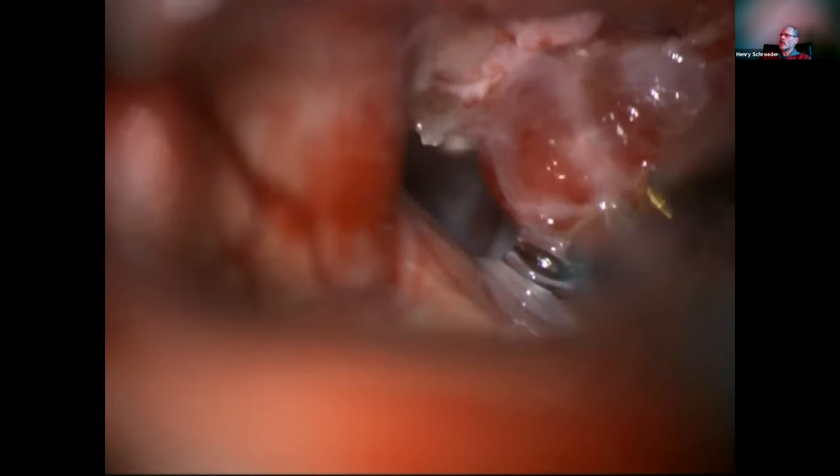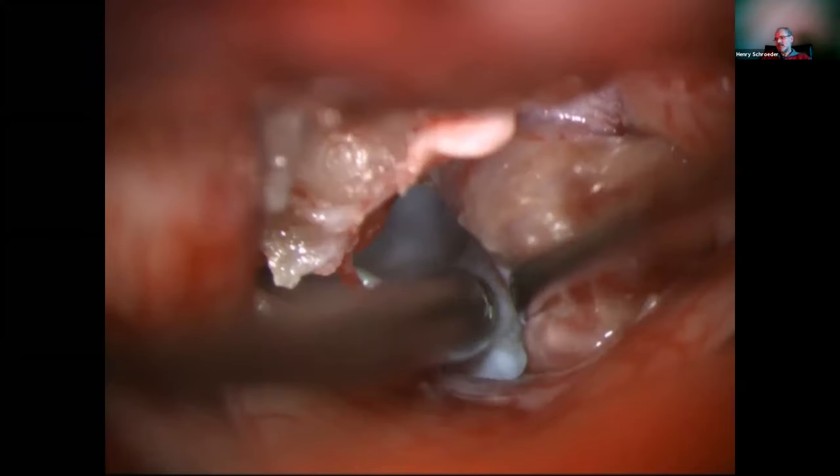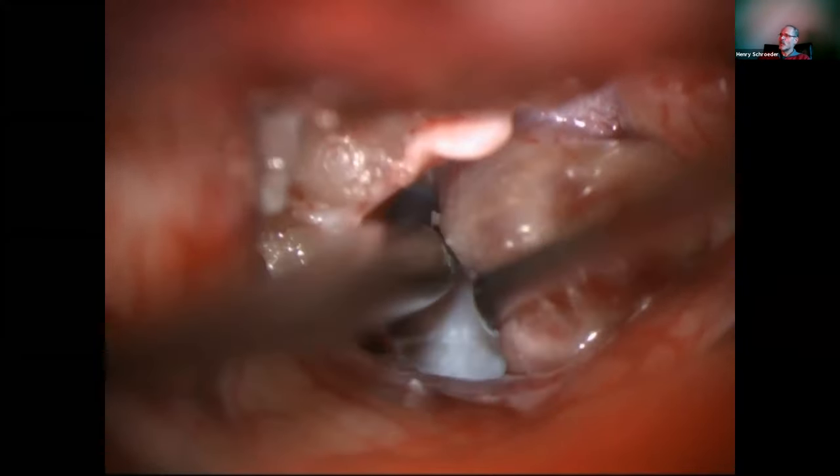So to bring the aneurysm into a clippable form, we shrink the aneurysm with bipolar coagulation, because we always have a problem with the vascular clips. They do not open widely enough. Sometimes it is difficult to get the aneurysm in the clip, especially in this case, we cannot use a straight clip or a banana clip, but we have to use a right-angled one, and then the opening is not very good.